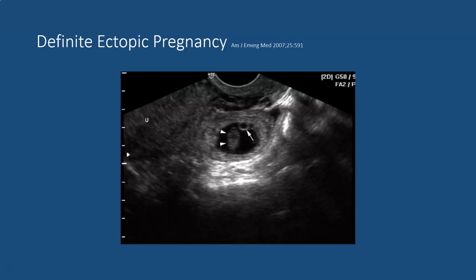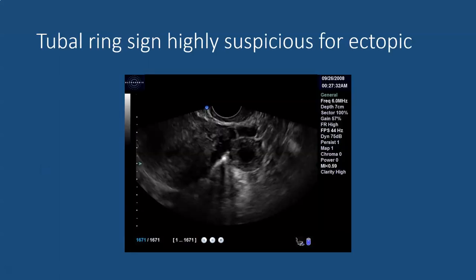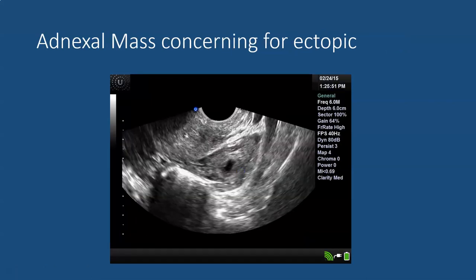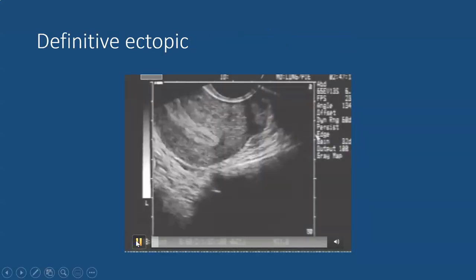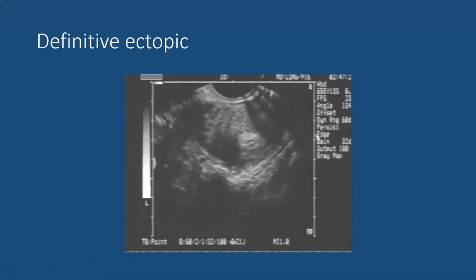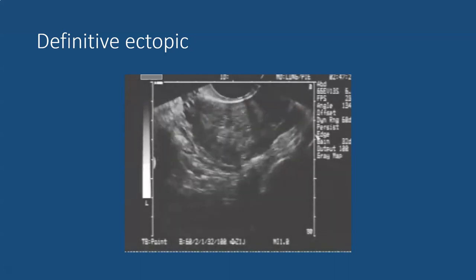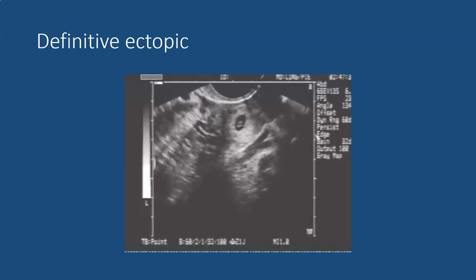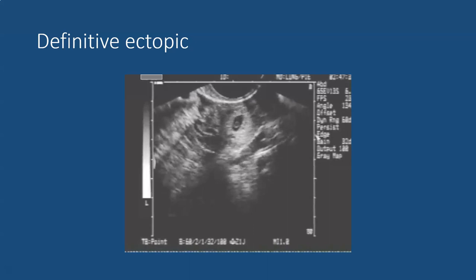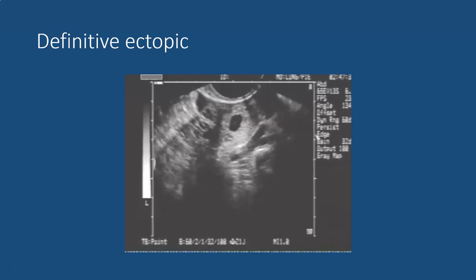Definitive ectopics are called definitive when you can see a clear yolk sac or fetal pole that is not in the uterus. Here is an example of an extra-uterine yolk sac and fetal pole. The tubal ring sign is highly suspicious for ectopic pregnancy — this is a thick echogenic ring structure in the adnexa. Sometimes all that one sees is an adnexal mass that is not definitive but is still concerning and suspicious for an ectopic. In some cases you may not see any adnexal mass at all. In this video clip one can see that the uterus is empty with a thickened endometrium, and as you scan into the adnexa you can see a mass which appears to be an extra-uterine gestational sac containing a yolk sac — this would be a definitive ectopic.